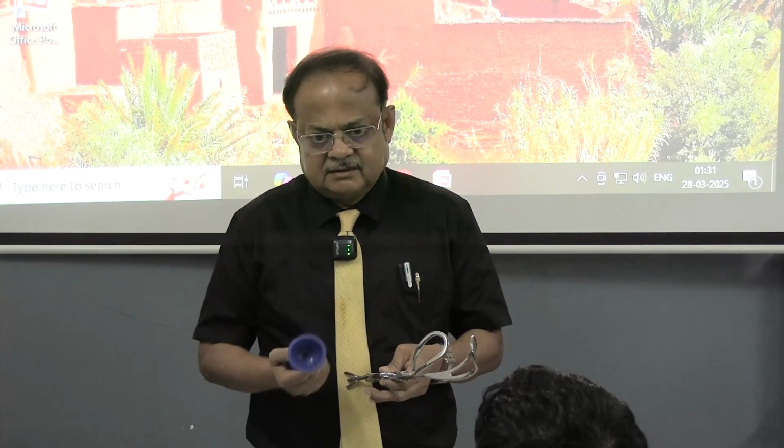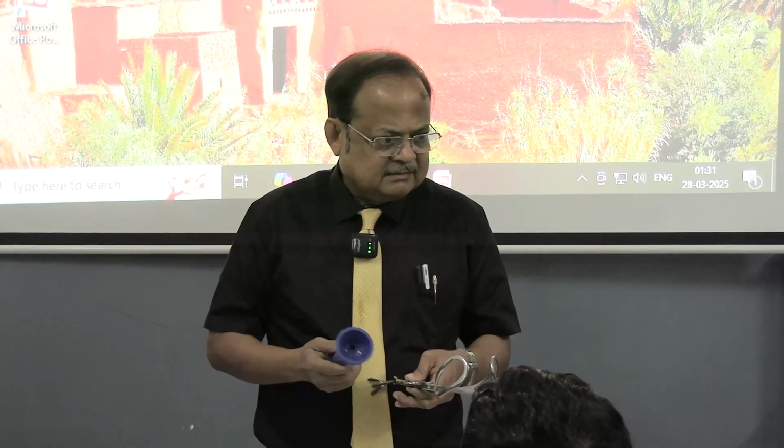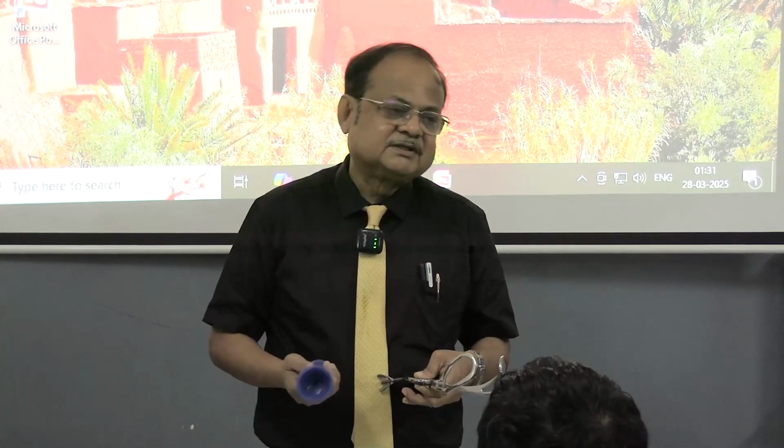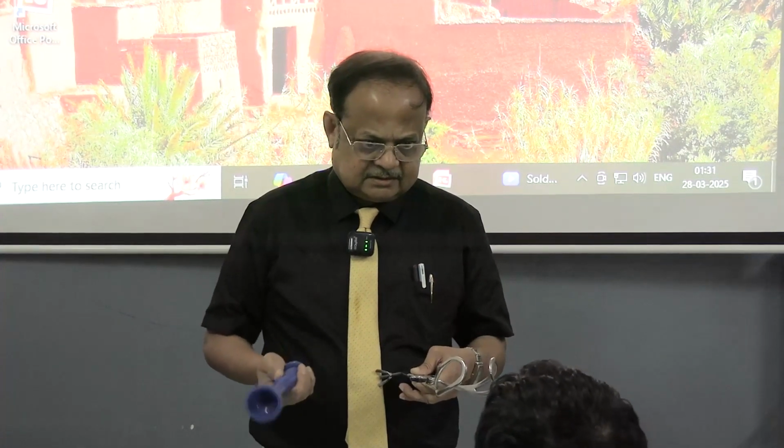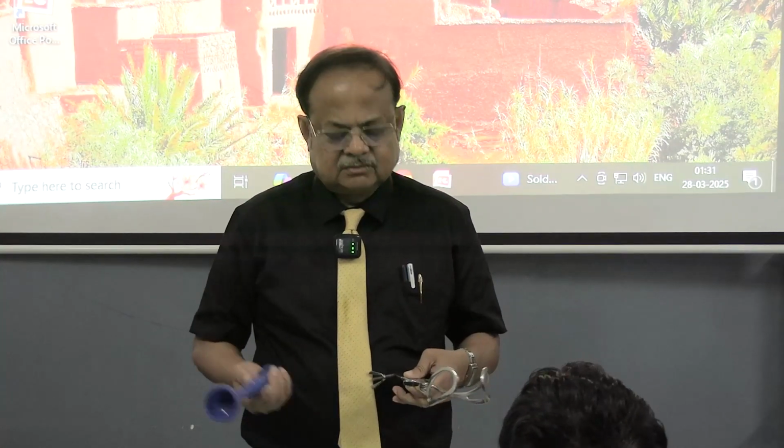They say it is not completely safe. Only you can say ventouse cup. The operation is known as the ventouse or the vacuum extractor, two names.